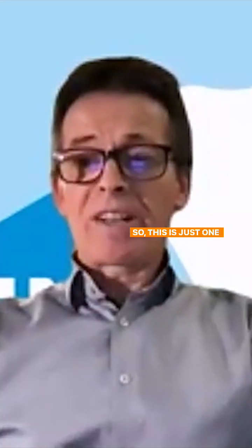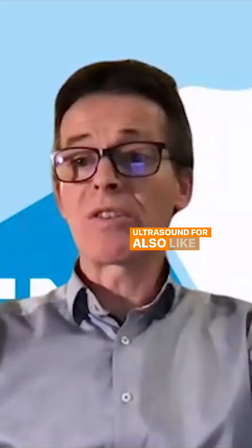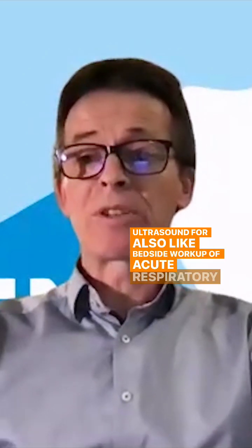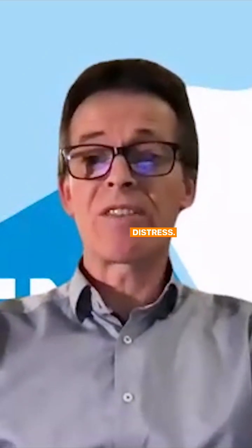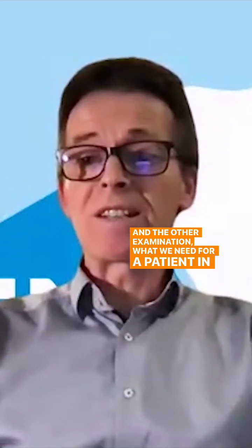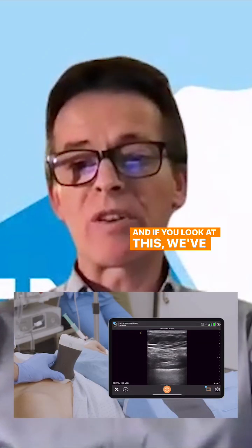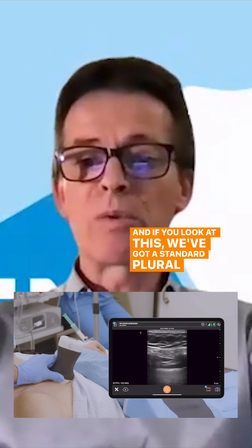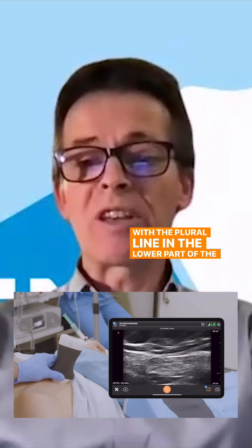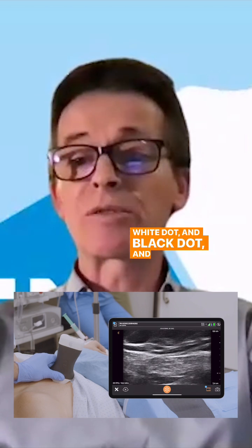This is just one example of how we can use ultrasound for bedside workup of acute respiratory distress. The other examination we need for a patient in dyspnea is of course a pleural scan. If you look at this, we have a standard pleural window with the pleural line in the lower part of the image, and now we zoom in on the chest wall.